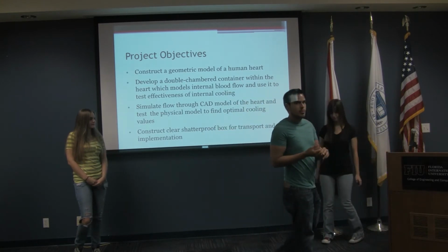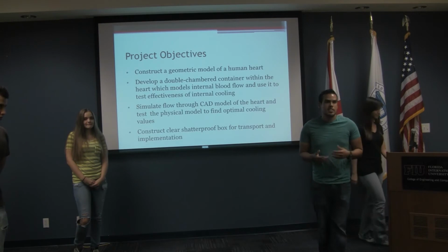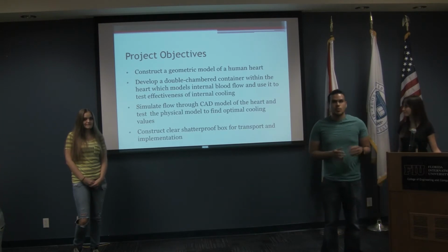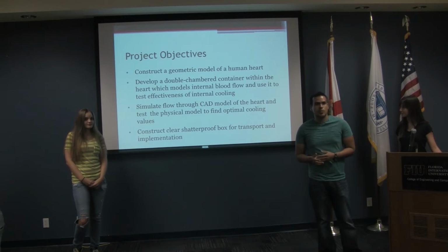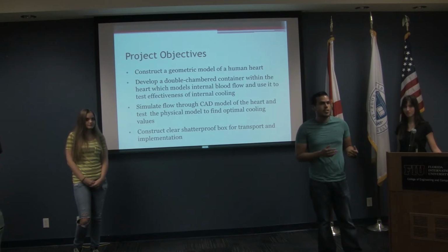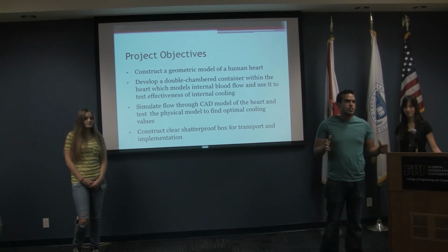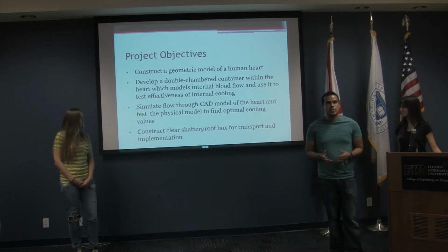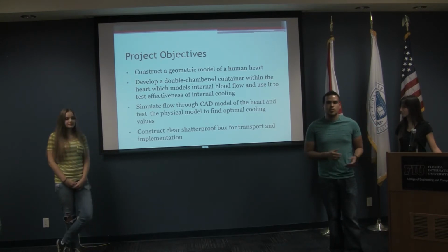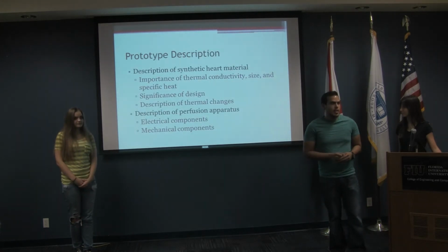This includes the thermal conductivity of the human heart, the specific heat, the density, and the size and geometry as well. We also want to use these same principles in designing a 3D CAD model for the drawing so that we could run computer simulations of the flow of the coolant within the heart, as well as showing the distribution of temperature within the heart, and ultimately constructing a see-through and shatterproof container that will be used as the pumping apparatus so that the coolant can be pumped through the heart.